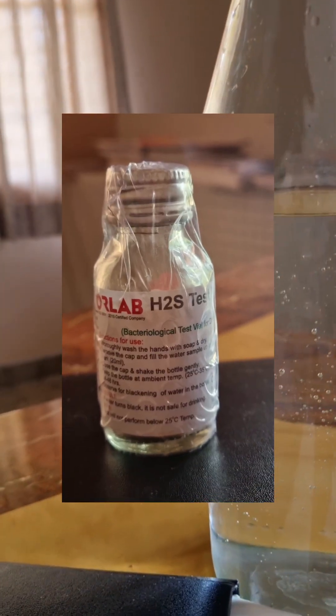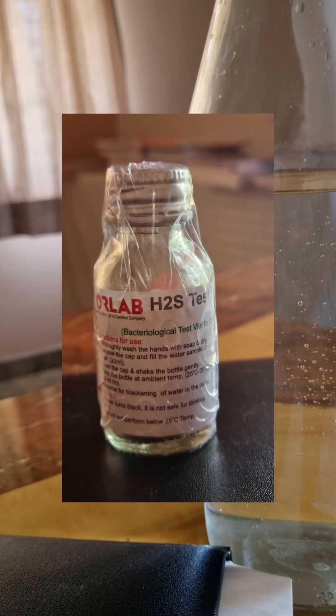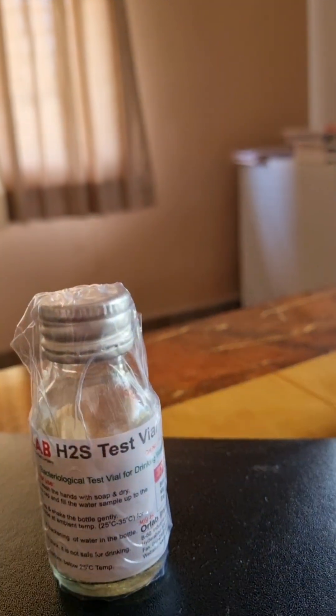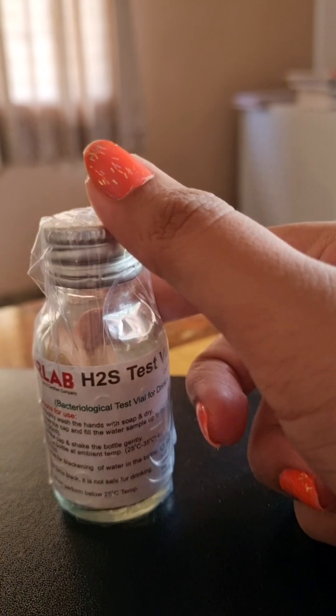Hi guys, welcome back. I'm here to share information where a simple test can tell you if the water you drink is safe or not. This is a hydrogen sulfide test.